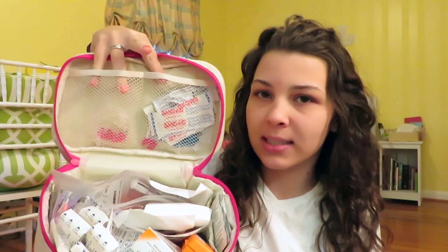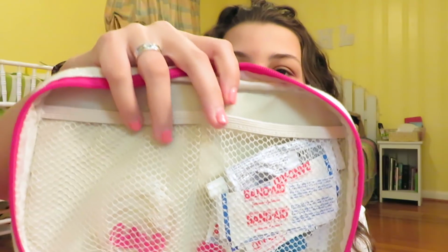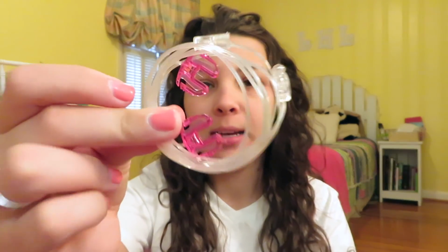So you open this bag up and it's kind of organized as best as it can be. So it has 2 elastic mesh pockets here, and then on either side down here there are little elastic pockets. So starting with these 2 pockets, in one of them I just have some tubings because I had to change my site a couple days early, a couple of times while I was down there, and I just saved these in case I needed them. So I just have a couple of those in there.